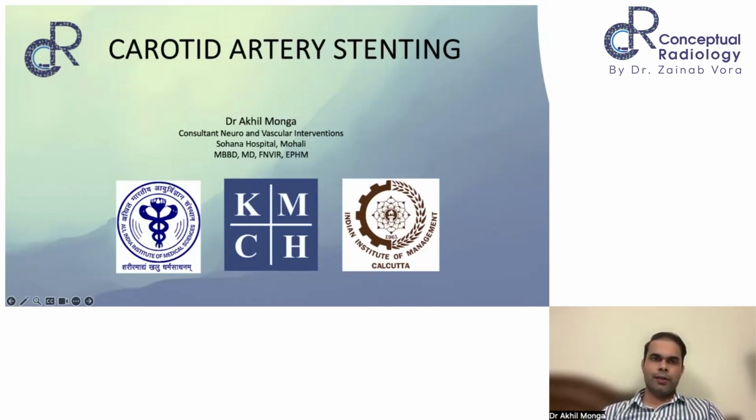Somebody might not have had a primary stroke but just incidentally found to have a stenosis, or sometimes they have a small stroke or TIA, that is a transient ischemic attack, and was found to have a carotid artery stenosis. So those patients can then be given the option of carotid artery stenting.